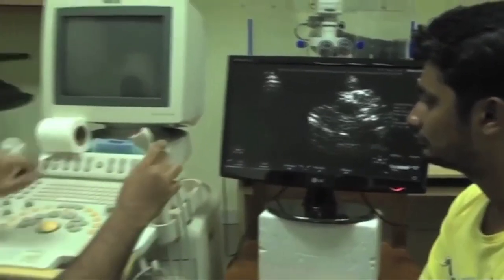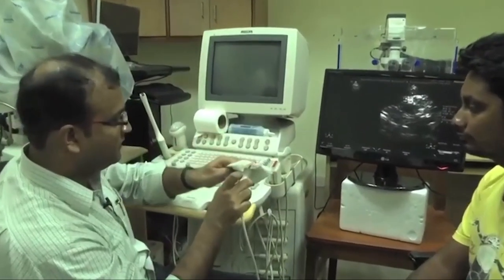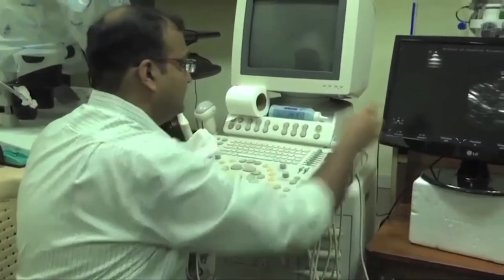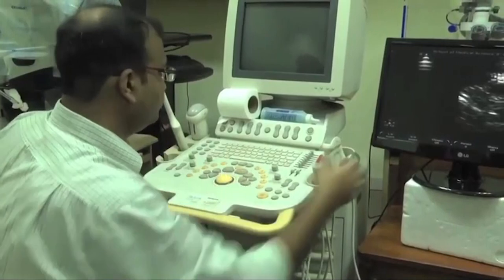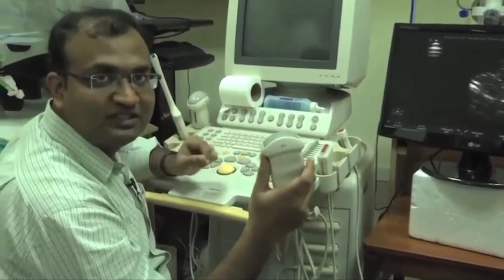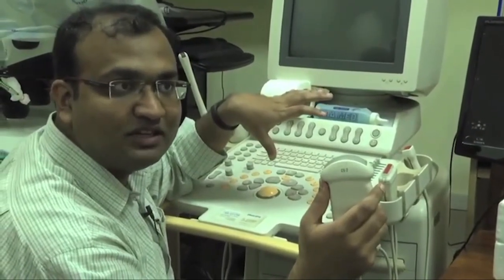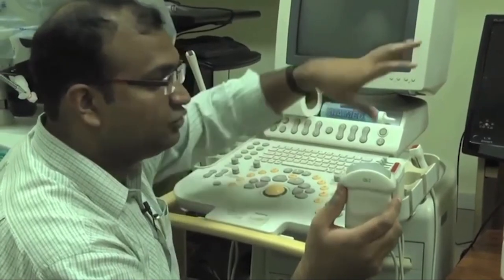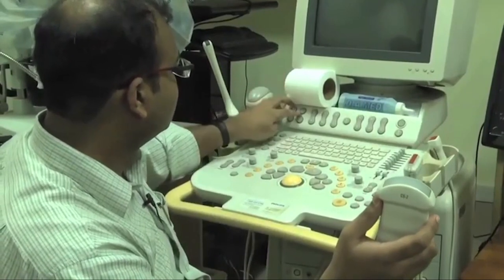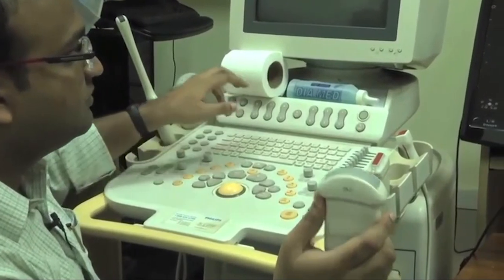Now let's move from one of these probes. As I finish off, I'm going to wipe off the probe as a standard practice and precautionary measure. Next, I am going to use this curvilinear probe. For that, I will have to do a hard switch within the system, because all my driver circuits, my amplifiers, my power drivers, everything will have to physically switch over to another probe which is electrically connected. So I have my switch over here, which is called probe. This is a probe flipping switch. So I switch over to that next probe.